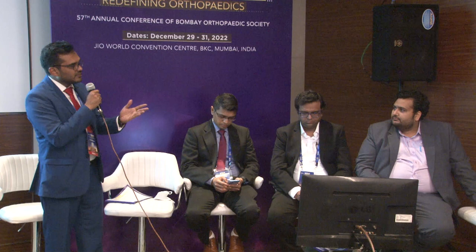I'd like to ask you a question, sir. In your root repairs, do you do a medial release to bring the root back to the insertion, as Dr. Laprade has described? Yeah, in certain chronic stages when the root is attached to the capsule, you have to do the release. I've shown that in the video. But yeah, it's always a challenge, as Bhushan has mentioned. We find the tears to be more medial and we still have to find a perfect answer for it.